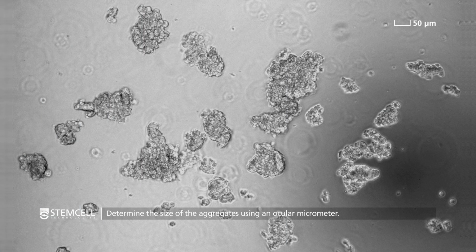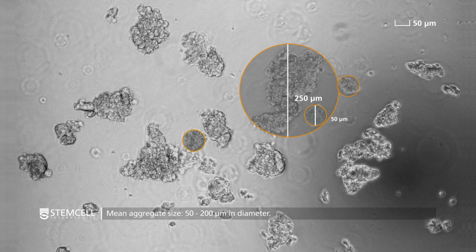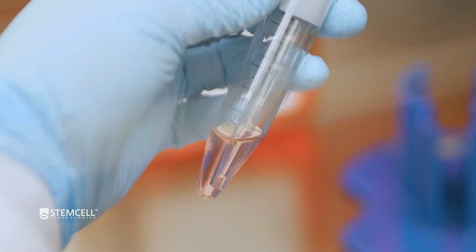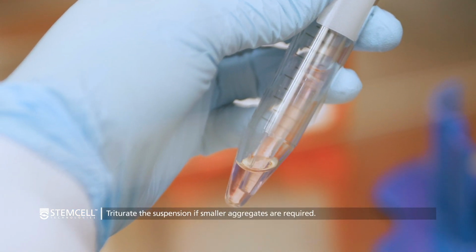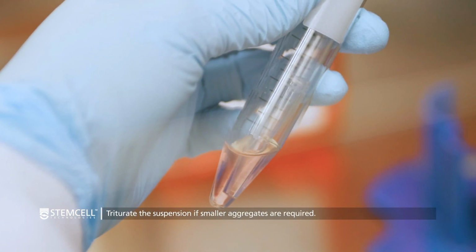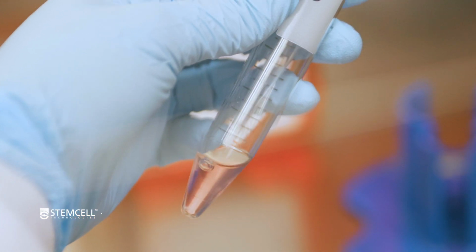Examine an aliquot of the aggregate suspension under a microscope fitted with an ocular micrometer to determine the size of the aggregates generated. Mean aggregate size should be between 50 to 200 micrometers in diameter. If the majority of the aggregates are above 200 micrometers, triturate the aggregate suspension by pipetting the suspension up and down until the desired aggregate size is generated.